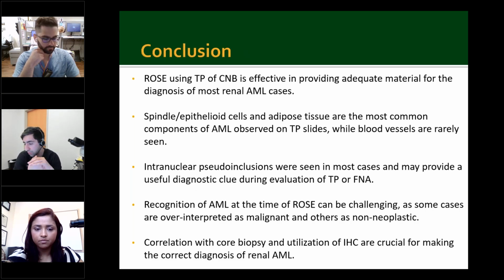Useful diagnostic clue during the evaluation of touch prep or fine needle aspirations. And correlation with the core biopsies and utilization of IHC are crucial for making the correct diagnosis of renal angiomyolipoma.